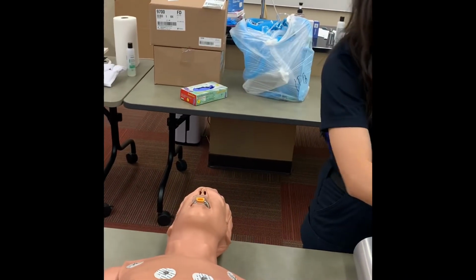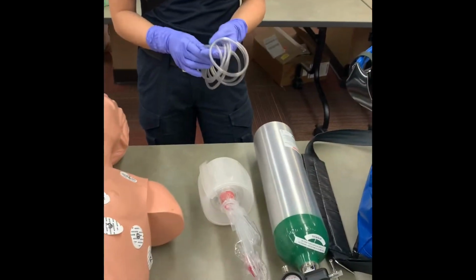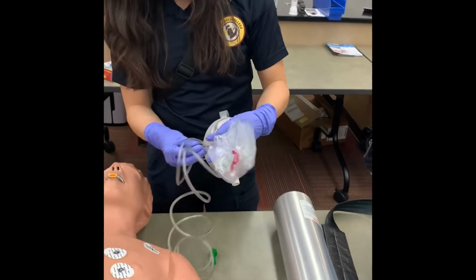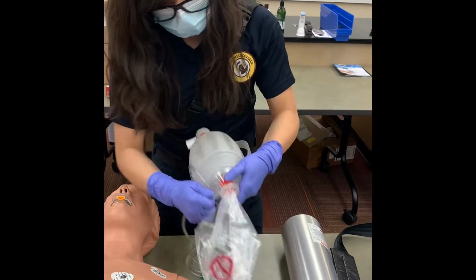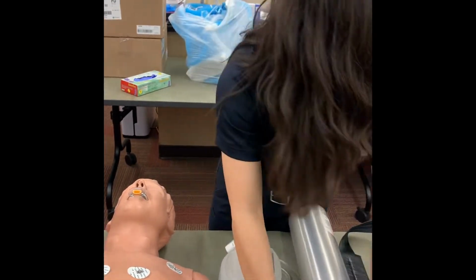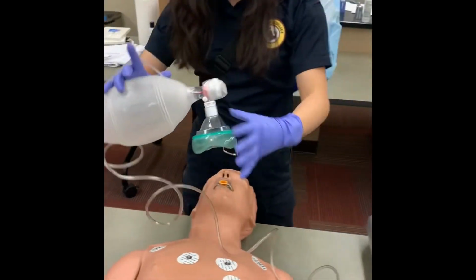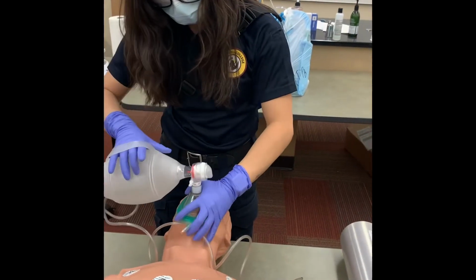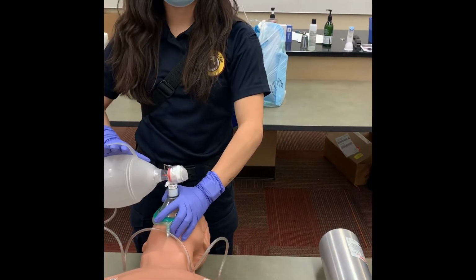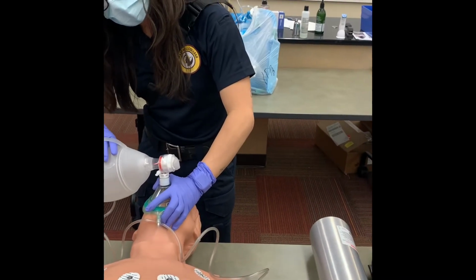Okay, so I'm going to go ahead and start assisted ventilations using a BVM attached to supplemental oxygen at 15 liters per minute. So oxygen is set at 15. Maintaining that airway open. Now we're gonna give ventilations, 1 every 6 seconds. Okay, so ventilations are being properly performed without difficulty.